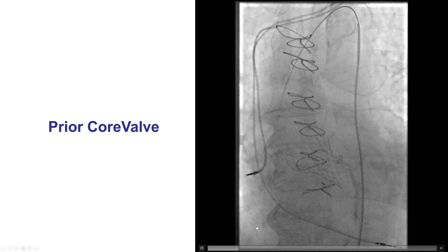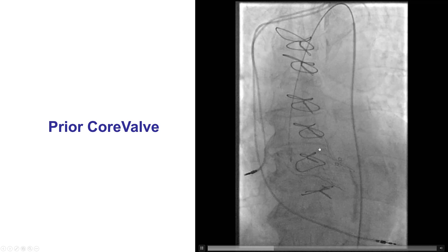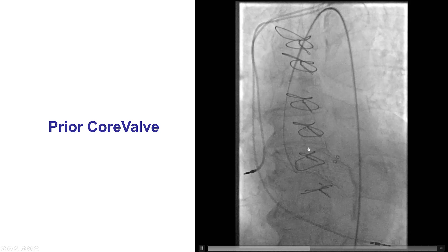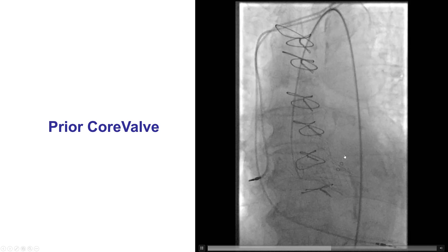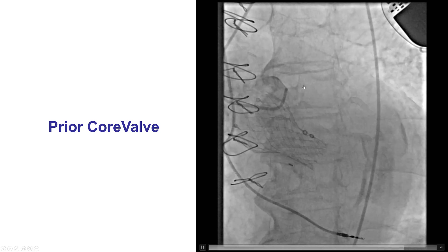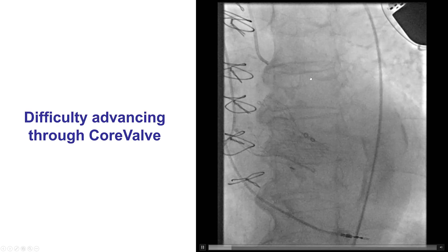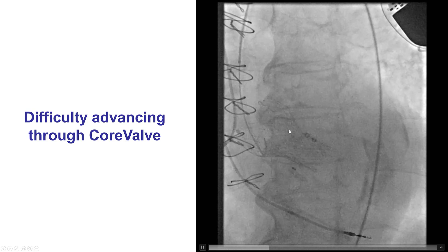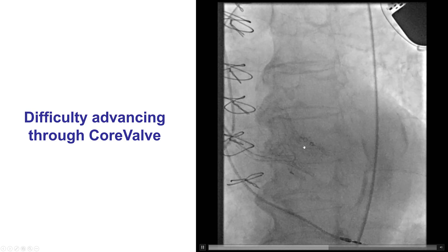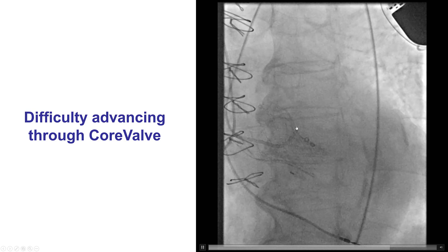This is an example of a patient who has had a CoreValve. To engage the valve, one uses a J-wire to get into the valve frame and then advances the catheter — in this case a JL4 catheter — aiming to cross through the valve and engage the coronary ostium. The initial crossing was fairly high in the aorta, so the catheter was repositioned, once again using a J-wire to get through the valve frame, and advancing the JL a little bit deeper to get it closer to the coronary ostium.